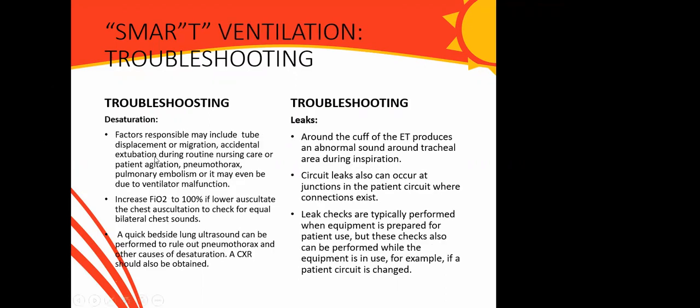A patient on a ventilator may desaturate. When this happens, you want to troubleshoot. Why is my patient desaturated? You want to look at the causes. I remember some years ago, during a nursing procedure, a patient was accidentally extubated. Instead of the nurse calling for attention, he just pushed the tube back. Obviously, the patient desaturated and arrested. So why is this patient desaturating under my care?